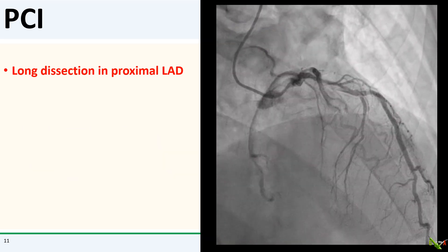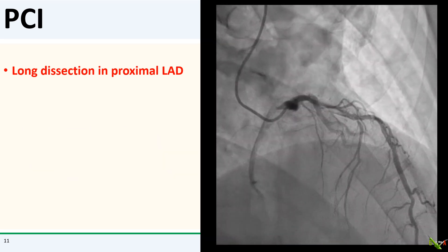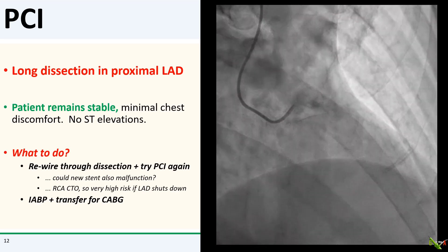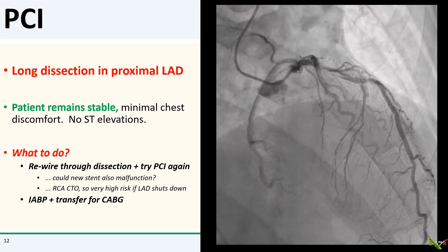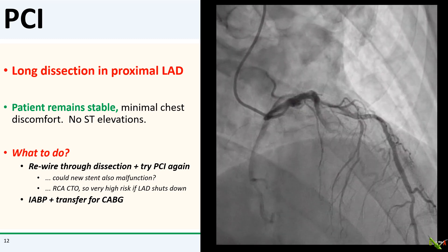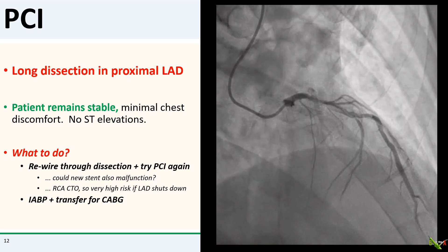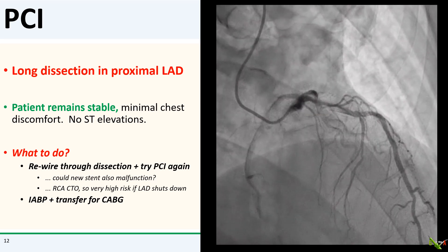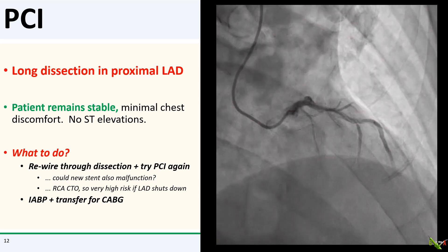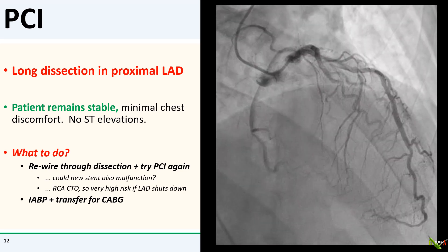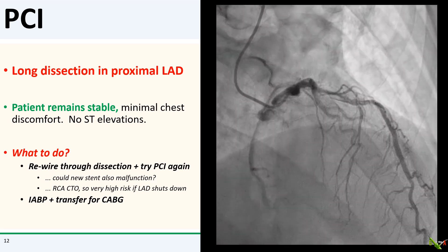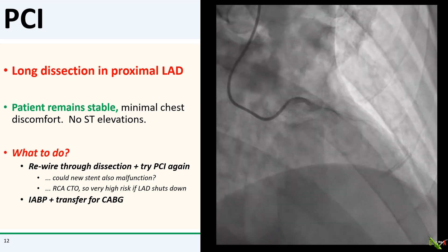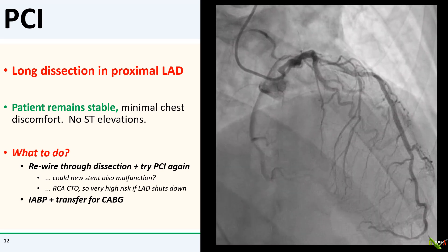This is what the LAD looks like now. There is a long dissection in the proximal LAD, probably going all the way back to the ostium. The patient remained remarkably stable — he still had minimal chest pain and no ST elevations. Option one would be to rewire through the dissection and try PCI again. But this patient has an RCA CTO, so wiring through the dissection is extremely high risk. If the LAD shuts down, we're toast. I was also worried about a second stent malfunctioning, as I wasn't sure what caused the first balloon to rupture.